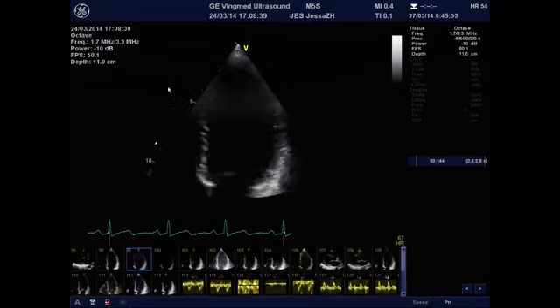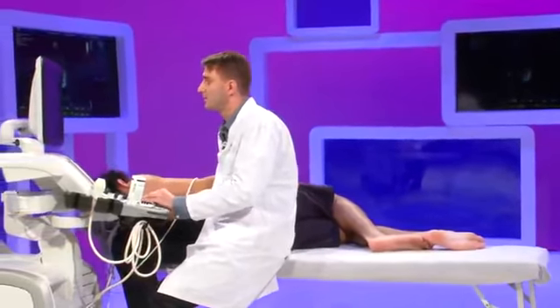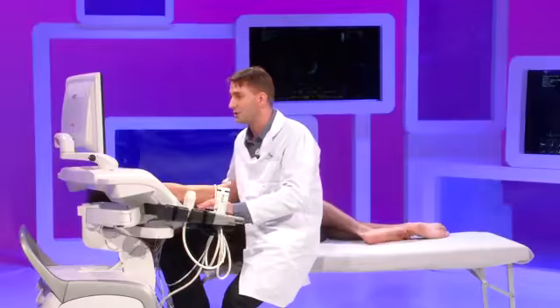So why not use maximal power all the time? Well, we are not sure. There are some examples where, when echo contrast is used with maximal power, we can have tissue damage. For instance, here the mechanical index and the thermal index give an indication of how much mechanical influence you have on your tissue and how much thermal effect, so heating, you have on your image. So the power of your echo machine should be as low as possible, with the best image quality.